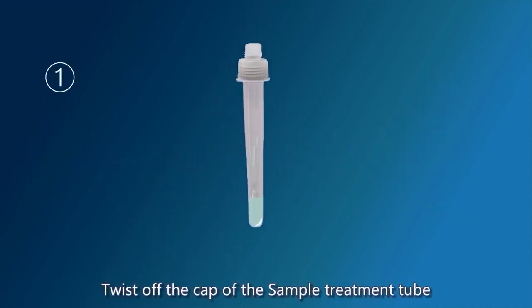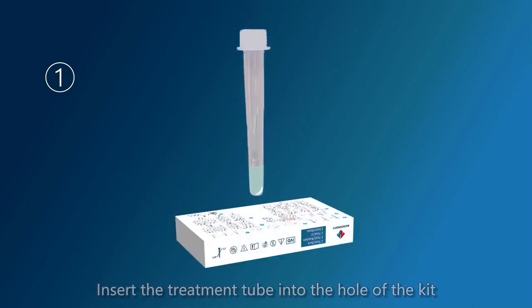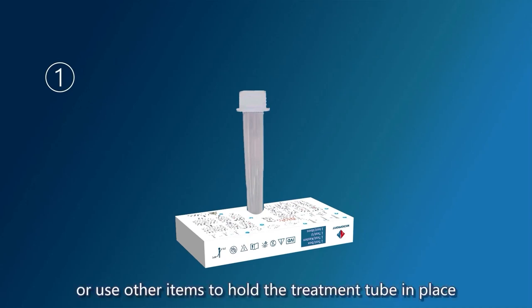Twist off the cap of the sample treatment tube and remove the inner blue stopper. Insert the treatment tube into the hole of the kit or use other items to hold the treatment tube in place.